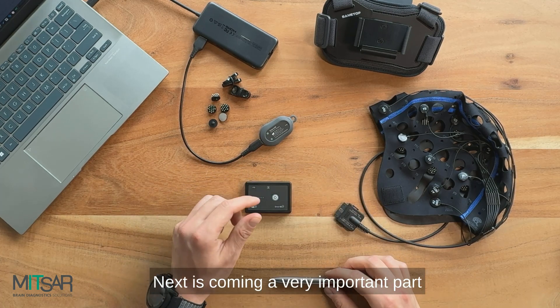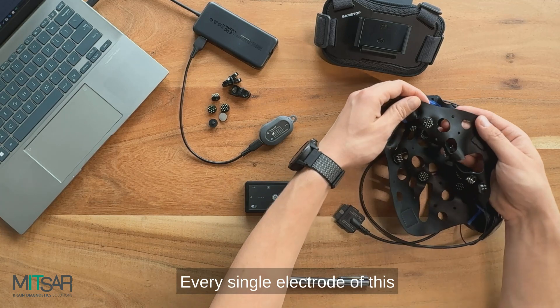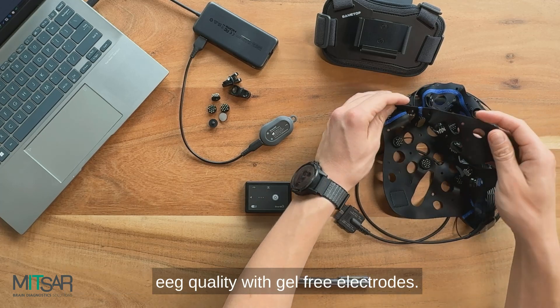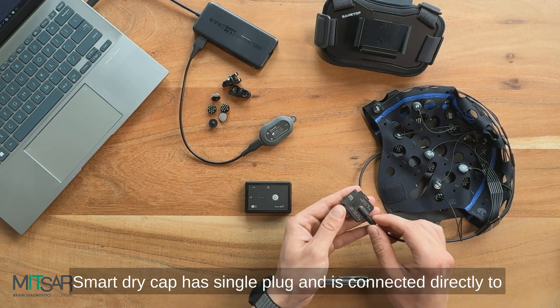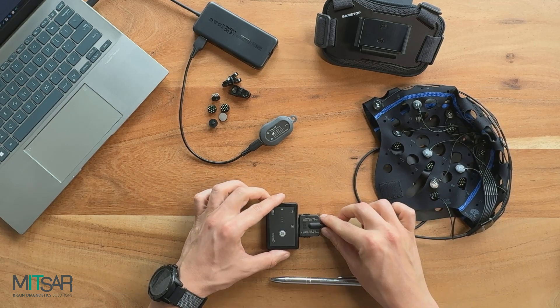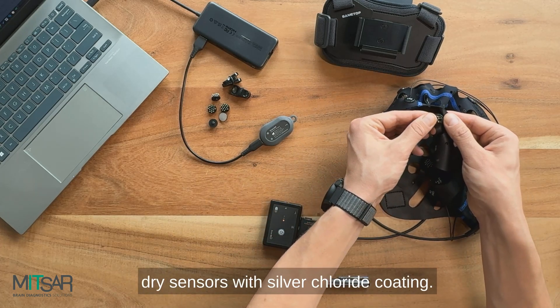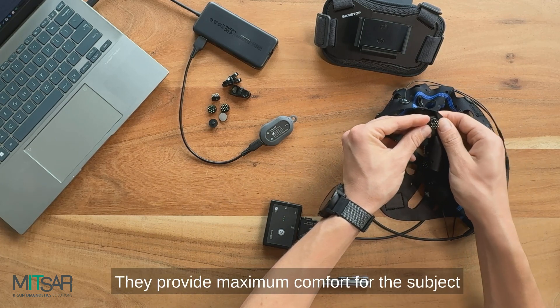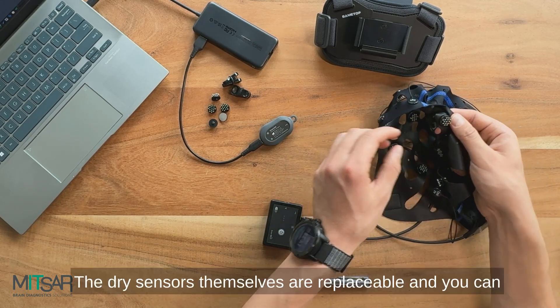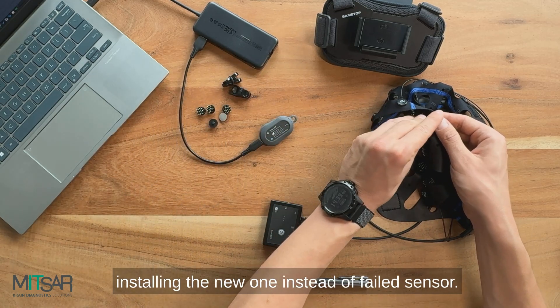Next is a very important part of the Smart BCI system — the EEG cap. Here we have our ActiveDry EEG cap, the SmartDry. Every single electrode of this pre-wired cap offers signal pre-amplification to provide better EEG quality with gel-free electrodes. The SmartDry cap has a single plug and is connected directly to the Smart BCI EEG amplifier and is powered by it. It comes with soft brush style dry sensors with silver chloride coating, providing maximum comfort for the subject during long-term EEG records, with optimal signal quality and no gel added. The dry sensors are replaceable — you can simply pull them out and install a new one in place of a failed sensor.